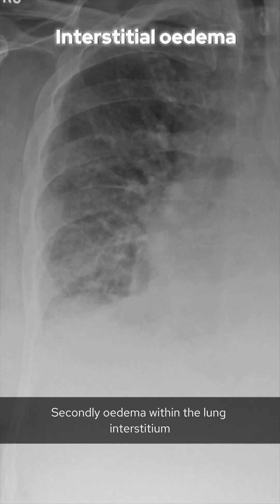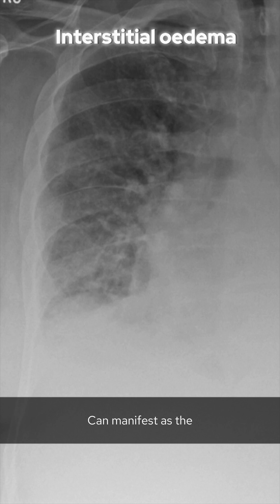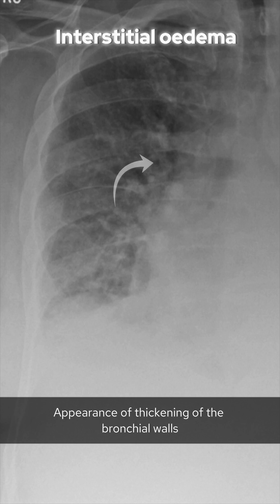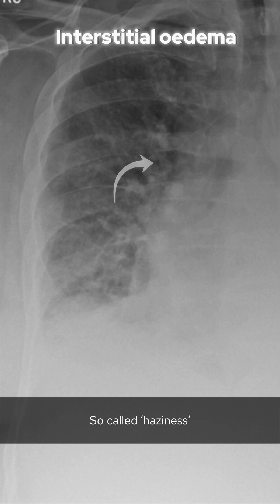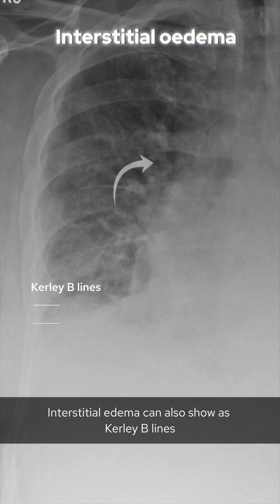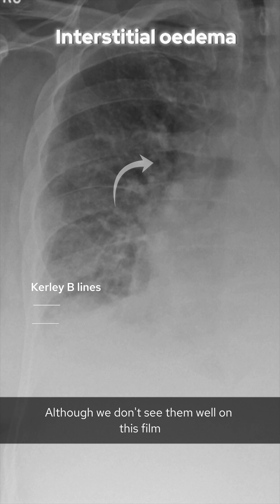Secondly, edema within the lung interstitium can manifest as thickening of the bronchial walls — so-called peribronchial cuffing — and these airways can lose definition, so-called haziness. Interstitial edema can also show as Kerley B lines, which appear as thin horizontal lines at the lung bases at the periphery, although we don't see them well on this film. On CT, we would see this as interlobular septal thickening.